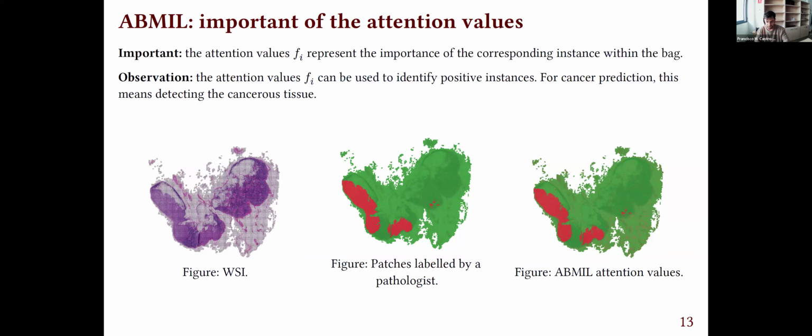So the goal of the second part of the Jupyter notebook tutorial will be to reproduce this from the start: preprocessing the data, creating the dataset, training the model, and visualizing the predictions.